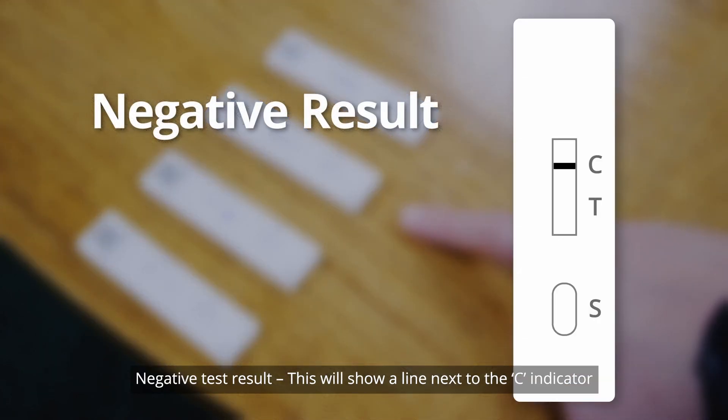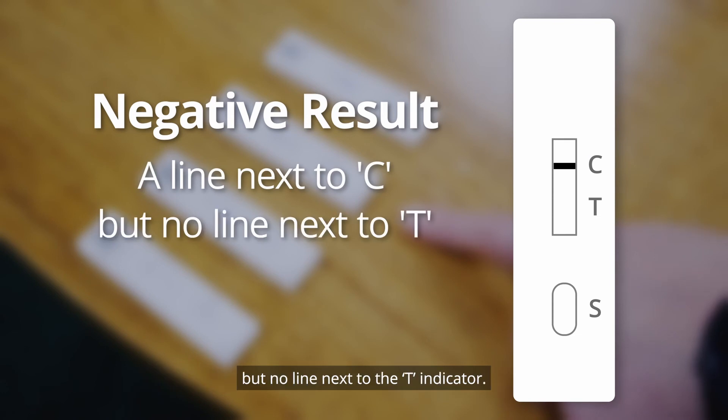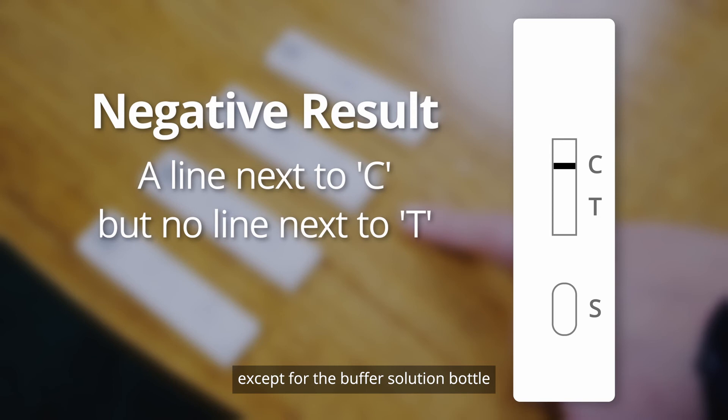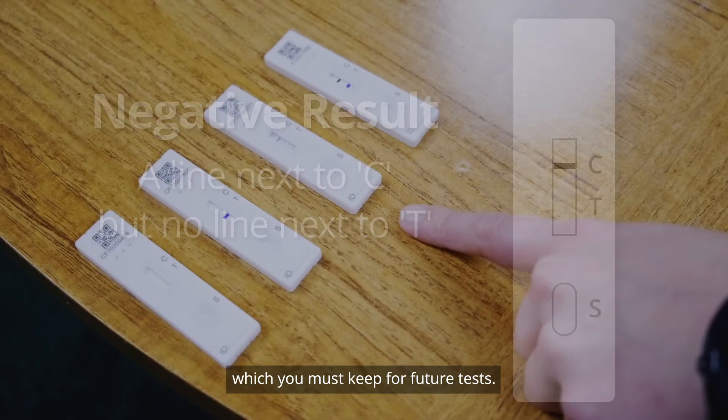Negative result: This will show a line next to the C indicator, but no line next to the T indicator. This means that you have a negative result and you may dispose of all the used items into your bin at home, except for the buffer solution bottle, which you must keep for future tests.